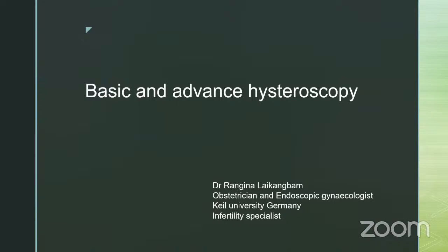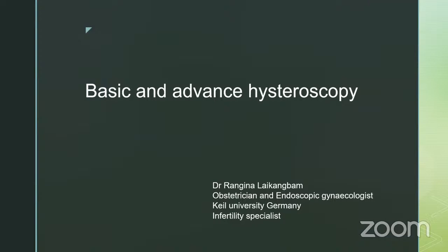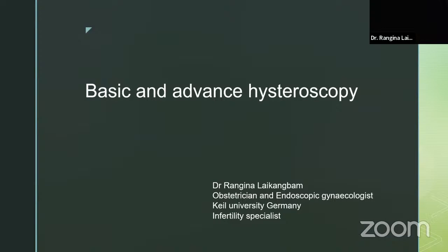Then the third question we received is: what precautions should be taken by the gynecologist or endoscopic gynecologist while performing this procedure? As I have mentioned in my slides also, the patient should not have a vaginal infection. While having a vaginal infection, we should not do any hysteroscopic procedure.